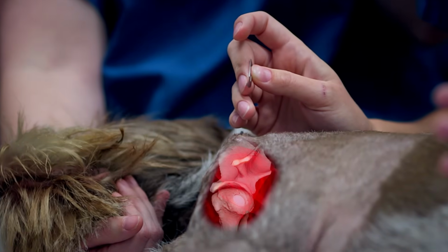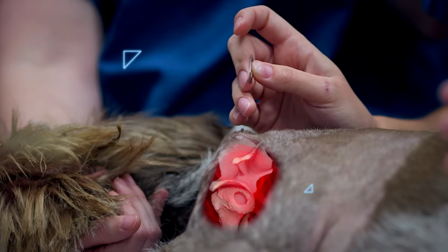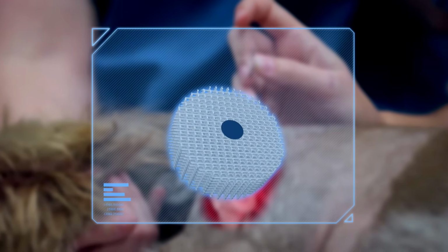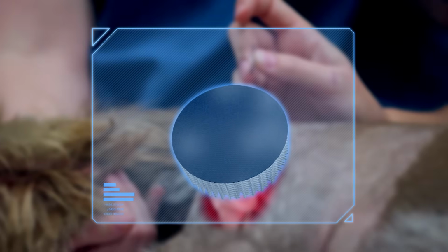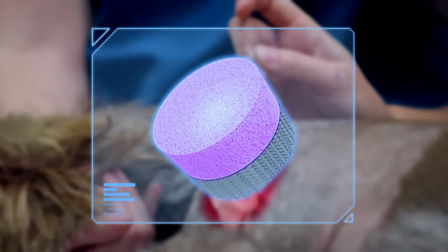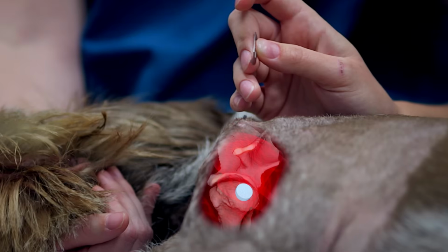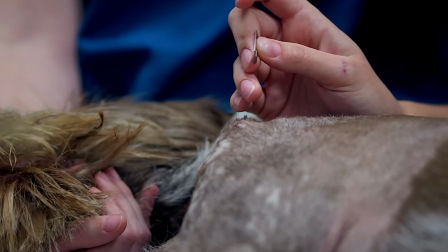Noel plans to fill the hole in Flo's shoulder with an implant that consists of a disc of porous titanium metal that's similar to the honeycomb structure of bone, topped by a carpet-like layer of woven fabric containing polylactide, a climbing frame for cartilage cells. It's seeded with Flo's cells, and more will be injected. Noel hopes over 12 weeks the cells will fill the hole in Flo's shoulder with new cartilage of the same type as she had before.